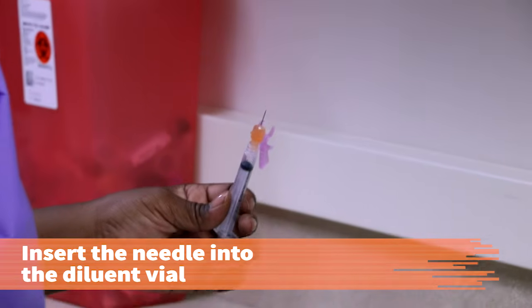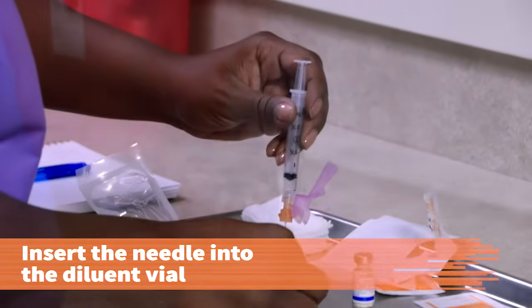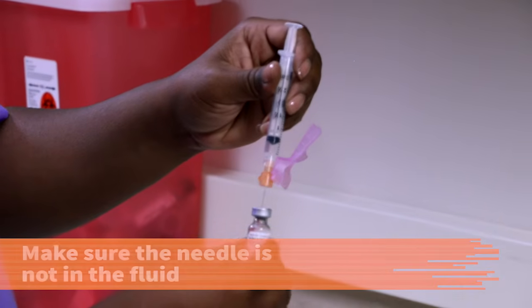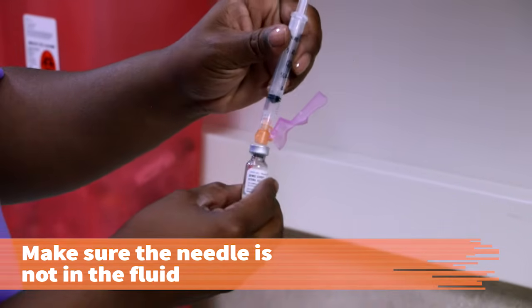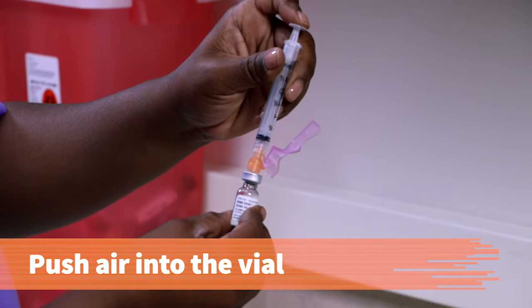Using the syringe with the aspirated air equal to the amount of diluent needed, insert the needle into the center of the rubber stopper of the diluent vial. Make sure the needle is not in the fluid. Push the air into the vial, but do not force the air into the vial.